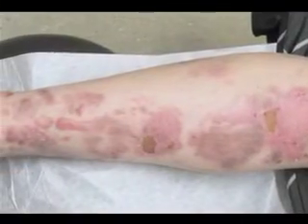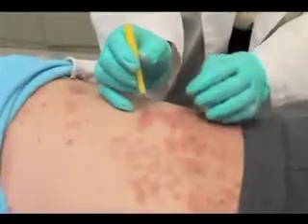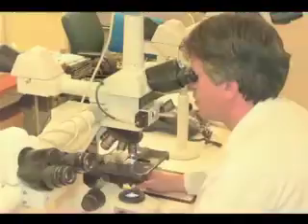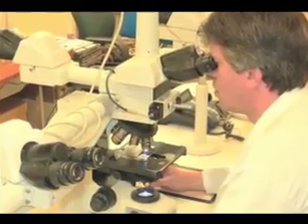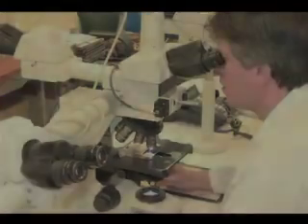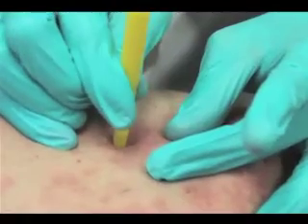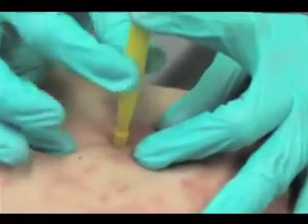Punch biopsy is the major method used for the diagnosis of many dermatologic conditions. Provided you select the site judiciously, are confident that you can achieve hemostasis, and have a pathologist to assess and diagnose histopathological features of the skin, the punch biopsy technique is a helpful procedure for physicians across a broad spectrum of specialties.